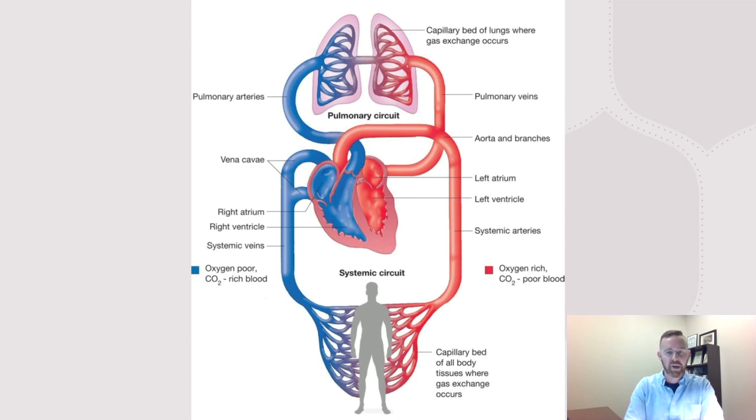So we're actually getting some pressure readings that tell us about the circulatory system as a whole, and specifically the central part of the circulatory system between the heart and the lungs. So of course we remember that people need to maintain perfusion of vital organs to maintain life. That's really our main focus and concern.